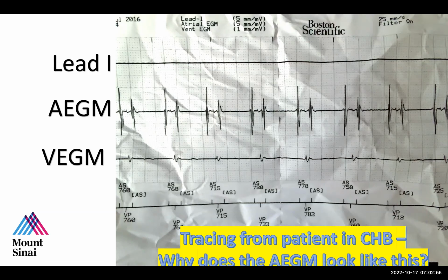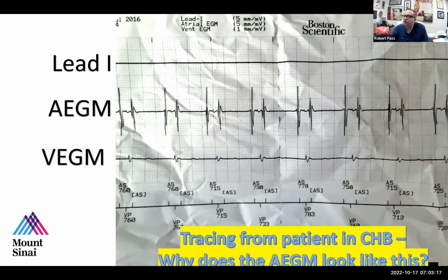And then I see also, between the atrial and the ventricular recording, there is like maybe an extra beat. You're referring to this signal here? Yeah. What this actually is: this is a transvenous system, and what we're looking at is the electrogram of the atrium, but also, as you said, this is a far field ventricular electrogram.